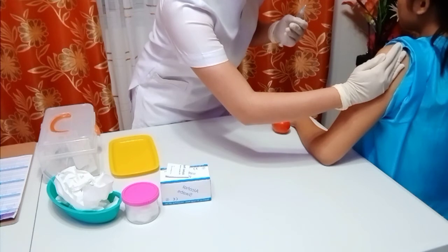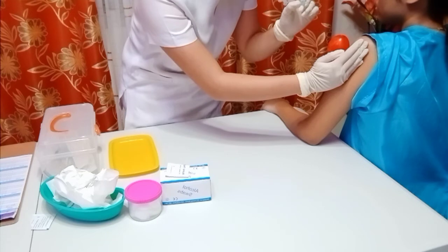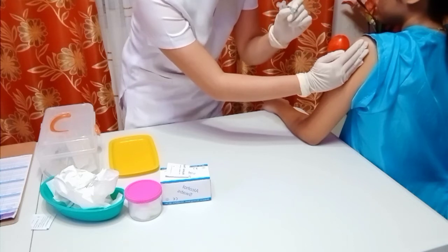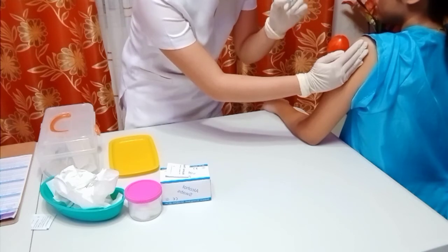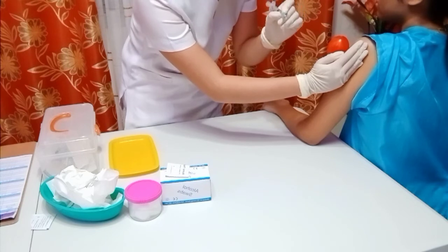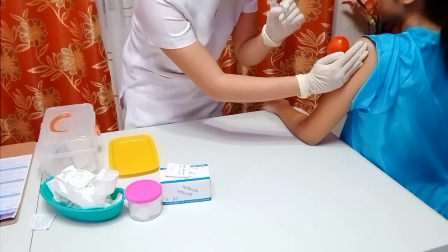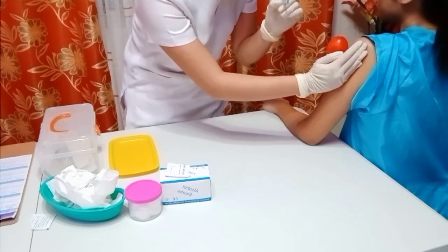Next is to hold the syringe between the thumb and forefinger of dominant hand. This position keeps my fingers off the plunger, preventing accidental medication loss while inserting the needle. Inject quickly and firmly at a 90-degree angle and insert the needle into the muscle. A quick insertion is less painful. This angle ensures me that the needle will enter the muscle tissue.